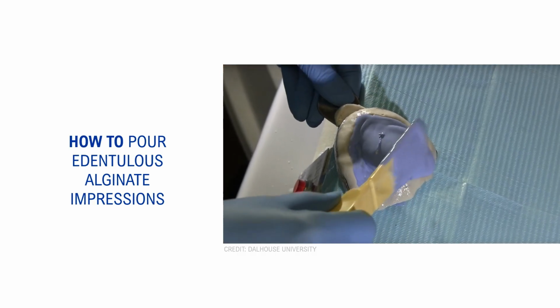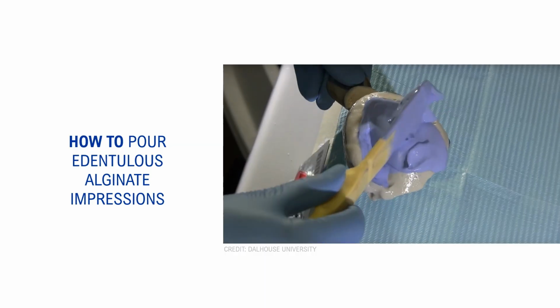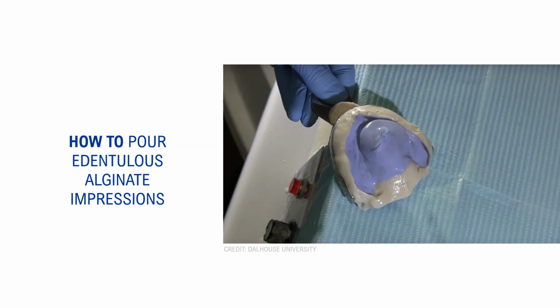You'll mix the microstone using the Whip Mix vacuum mixing bowl, and take your impression without the boxing wax to the vibrator and start pouring. Use the lowest vibration possible to avoid creating bubbles in the stone. Pour the microstone, and yes, it will run towards the palate. Keep it at an angle to avoid that as much as possible.